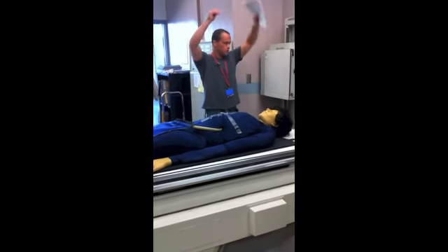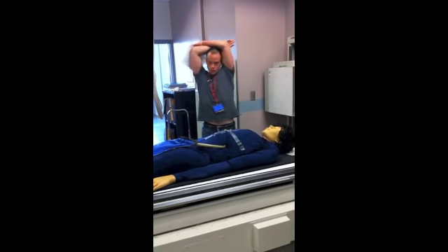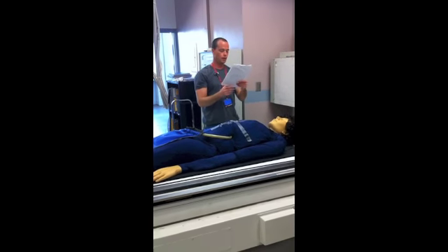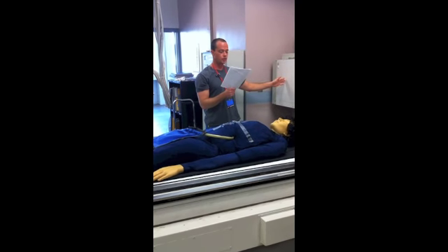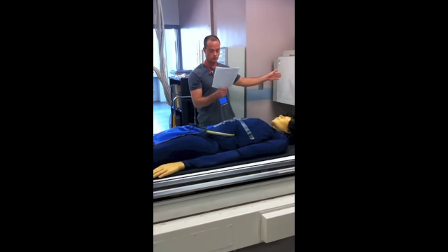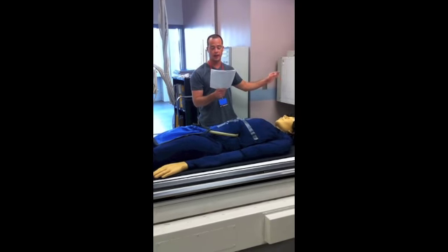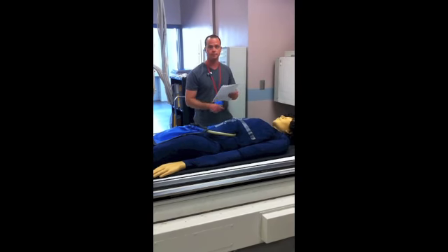I'm going to have the patient put his arms up above his head like this. If he can, hands on opposite elbows. And again, the central ray is perpendicular to the IR, and it enters the patient at the level of T7. We want it to enter the patient on the patient's mid-coronal plane, again at the level of T7 and the inferior angle of the scapula.